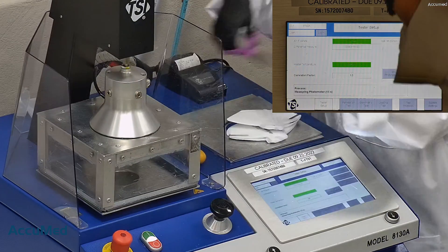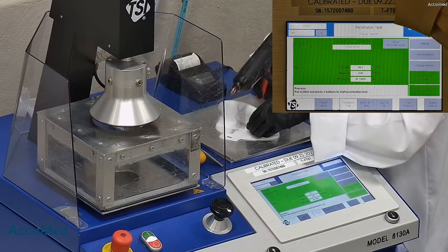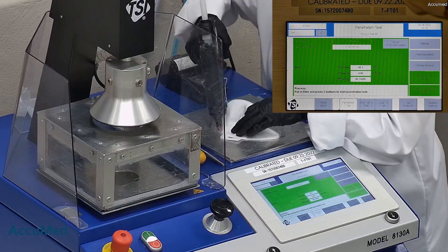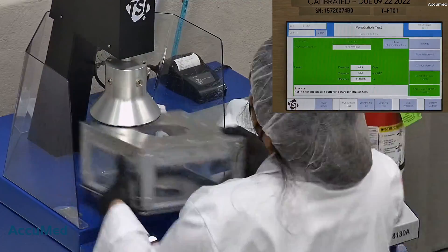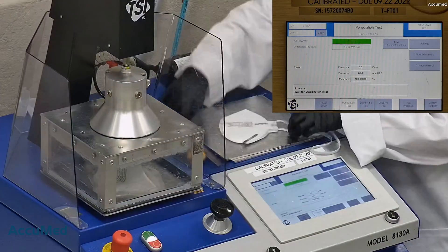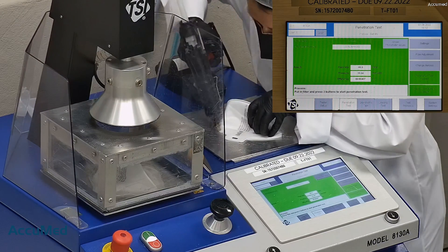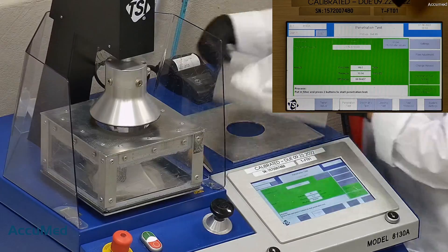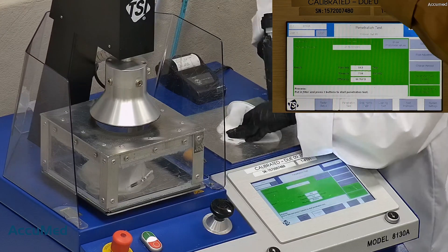Let's go ahead and test these with our TSI machine. This is our TSI machine model 8130A, which is the same filtration testing machine that NIOSH uses to approve N95 respirators. Our testing procedure is also inspired by NIOSH. We first run a tester setup and remove the headband from the respirator before placing it onto the testing plate to ensure a proper seal. Then we make sure that the mask is completely sealed with hot glue to the testing plate, ensuring no leakage or holes around the seal for accurate results. The testing plate is then attached to the frame and placed under the TSI filter holder for testing, which tests for both particle filtration efficiency and pressure drop.